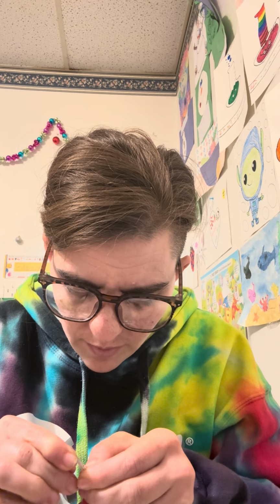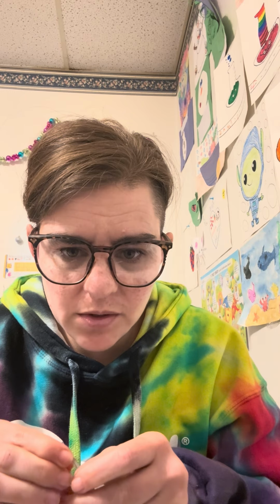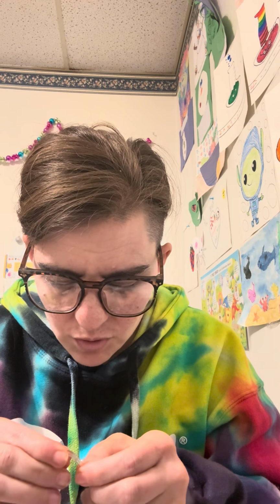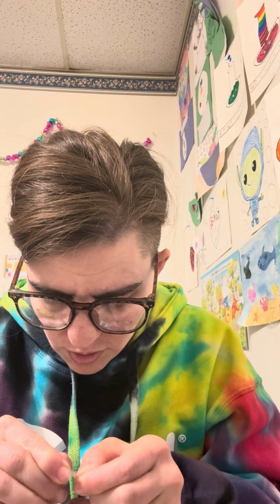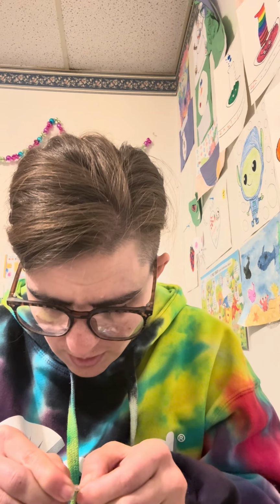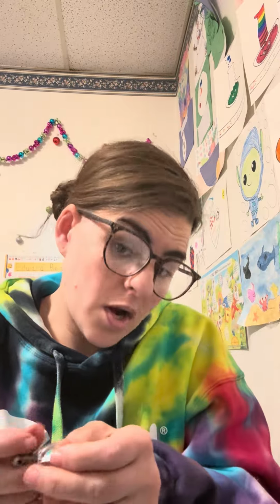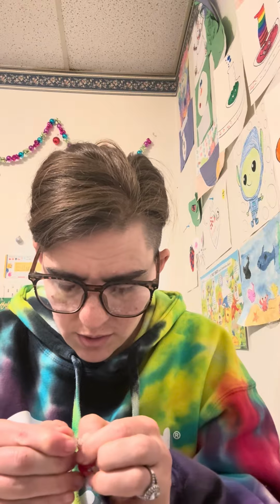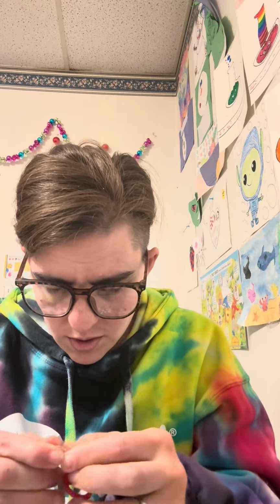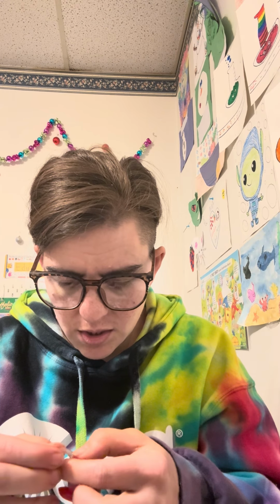I definitely recommend, if you have a new mold, to see if you can borrow one from your audiologist, because once your mold is much more loosened up, you might not need it. It's just that some people might need it forever. So now I'm sticking it back on, putting it back on my ear, and we're going to try this again. Get it secured on there, and then put it back on your ear and try again.